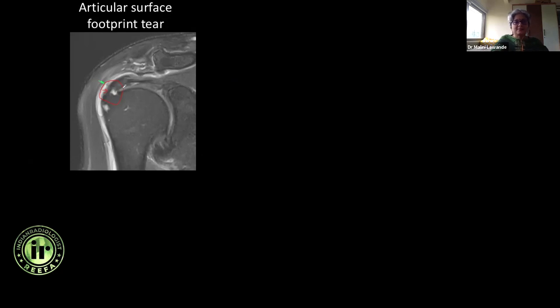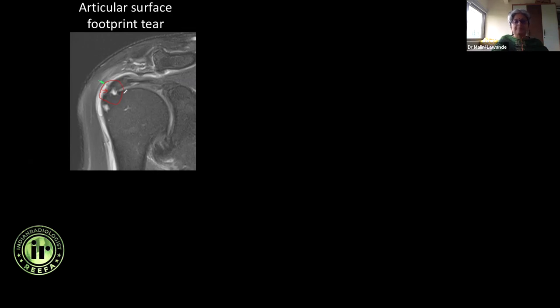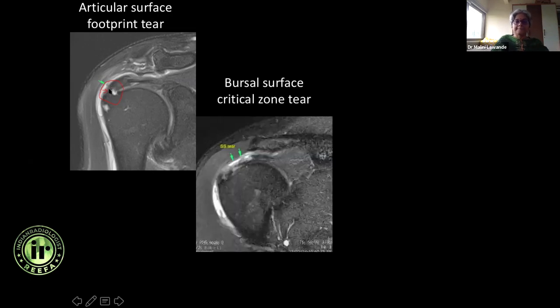I always like to use the 50 percent threshold — is it more than 50 percent thickness or less than 50 percent thickness? You may say more than 75 percent thickness, or near full thickness when barely a few fibers are intact. So this is something I'd call more than 50 percent thickness supraspinatus footprint undersurface or articular surface tear.